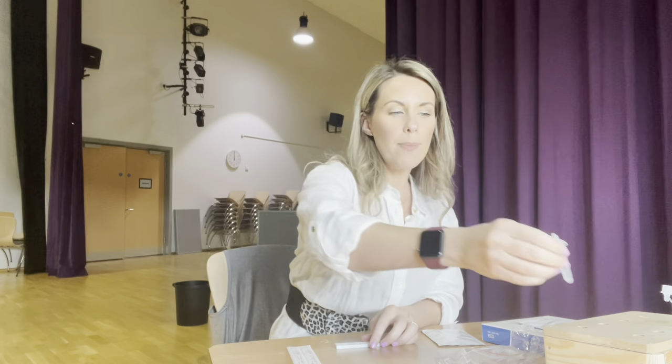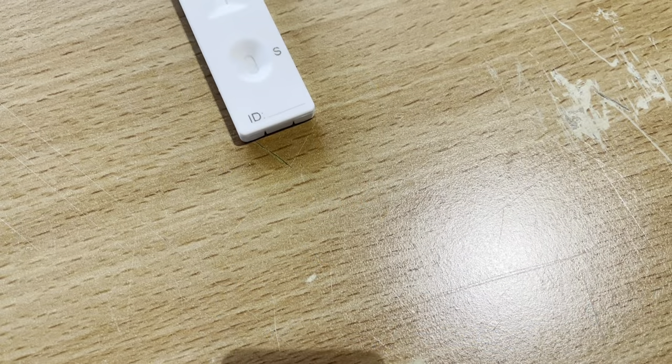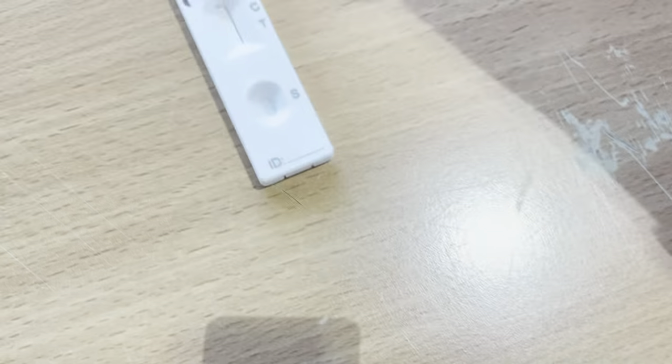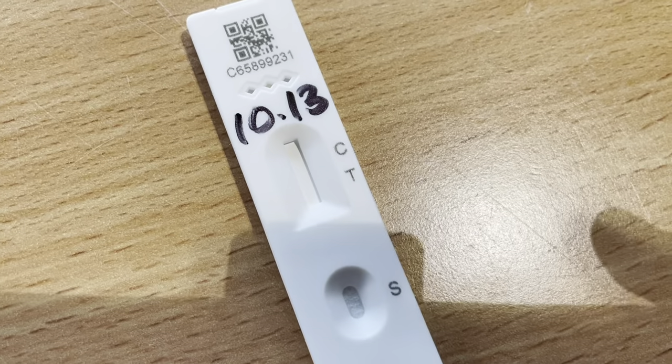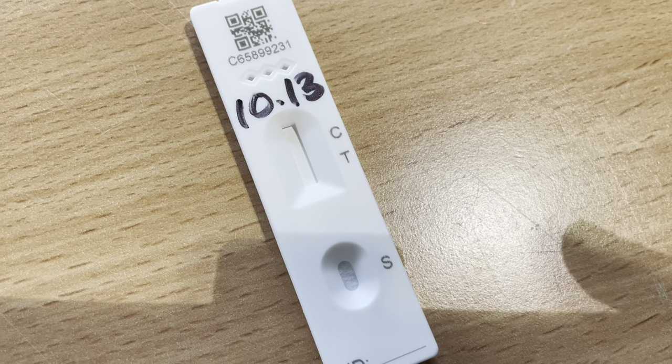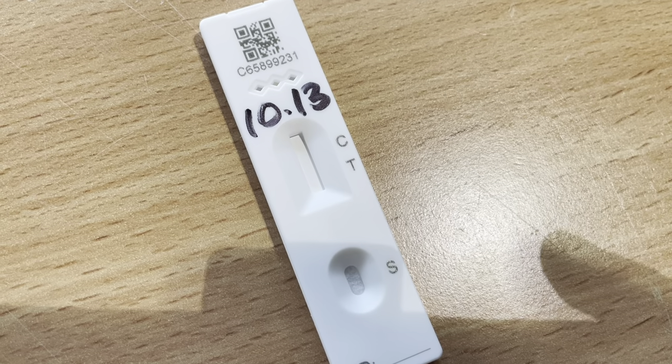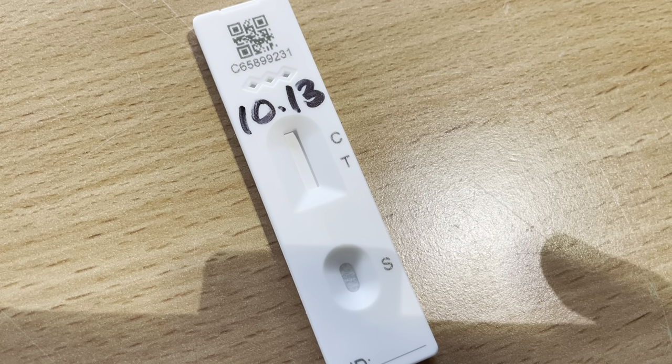You don't want air bubbles — you just want a nice clear two drops. Once you've placed two drops of the solution in this section, make a note of the time and write it on the top of the test using a Sharpie pen or marker. You will then wait for 30 minutes before processing the results.